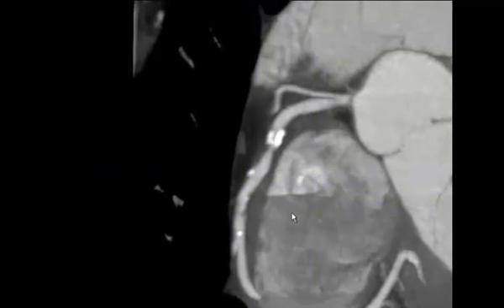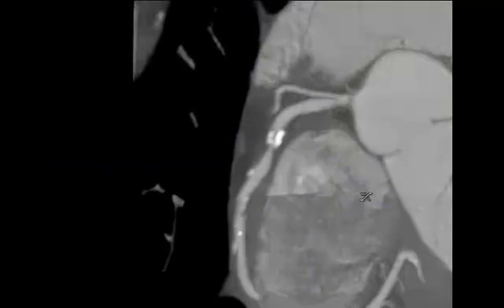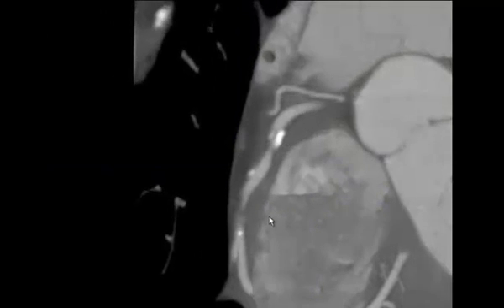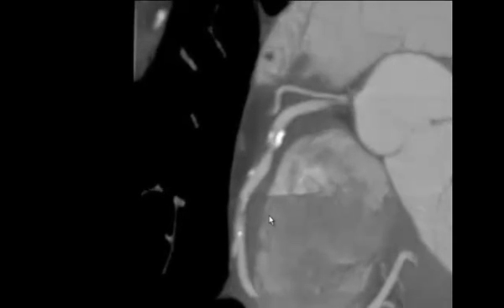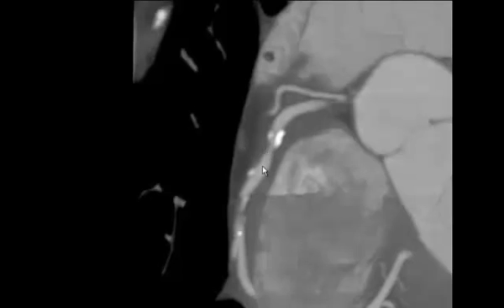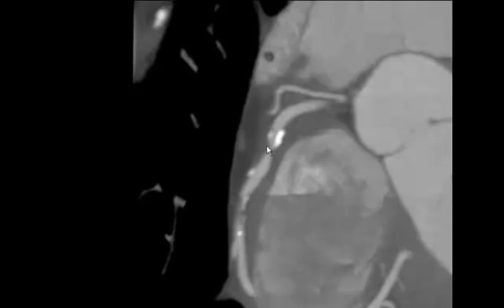There is quite a bit of calcified plaque which is noted, and I'll drag this to the center here slightly, widen the window to try to diminish some of the blooming effects, and although we can definitely ascertain that there is a continuity of contrast material here, there is a choke point just distal to the areas of calcified plaque.